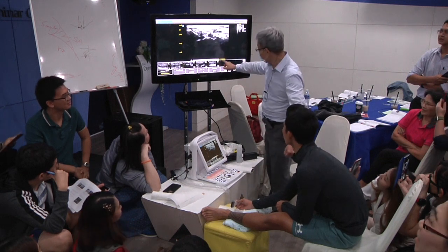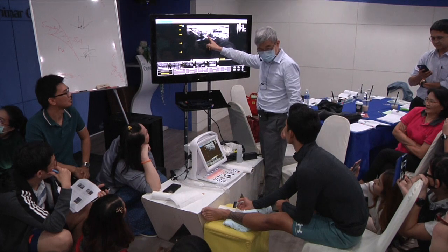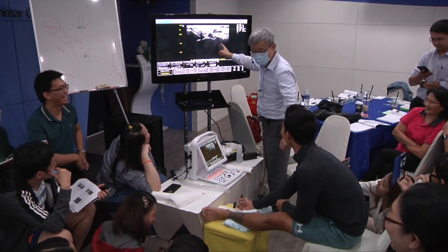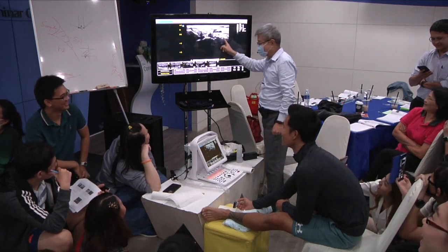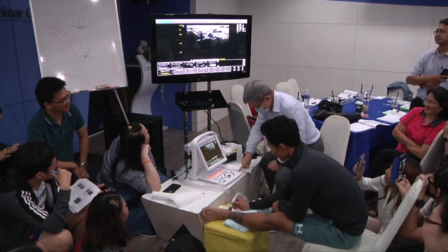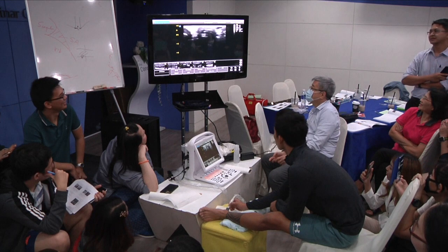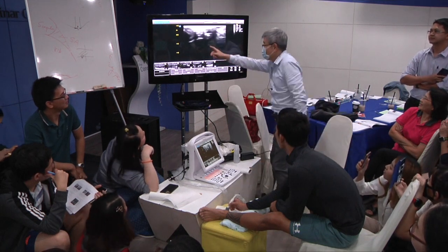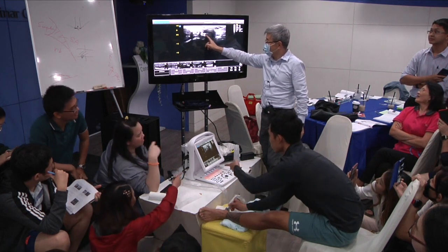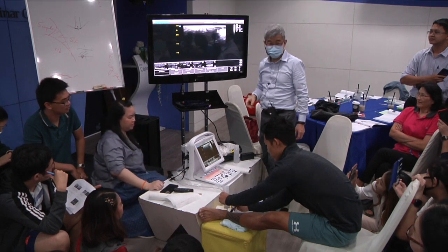So, okay, don't move. Your first girlfriend, second girlfriend, third boyfriend. Girlfriend. Sorry. This is the last girlfriend you are going to look for. Move. Sorry, I was a little bit tired. Yeah. Good. Your first girlfriend, second girlfriend. Yes, third girlfriend. Because this is very bright. Because this is artery.